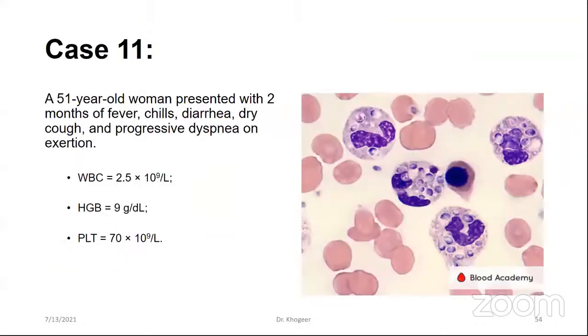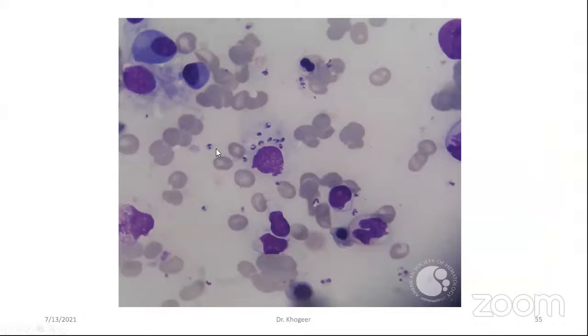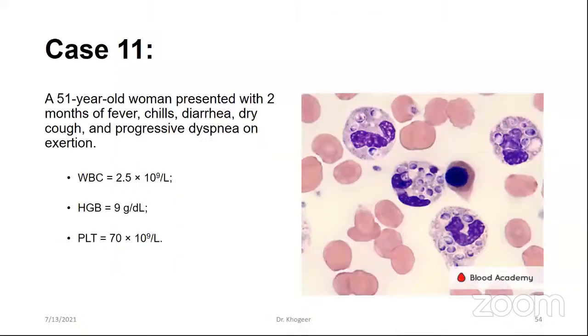When we compare it, for example, with Histoplasma, see, Histoplasma has large, round, dark inclusions. This is why it's called capsulatum. So it can easily be differentiated from the small inclusions distributed extracellularly and intracellularly. And this is what we call the kinetoplast, and usually it's characterized by a double dot appearance, not like Histoplasma.